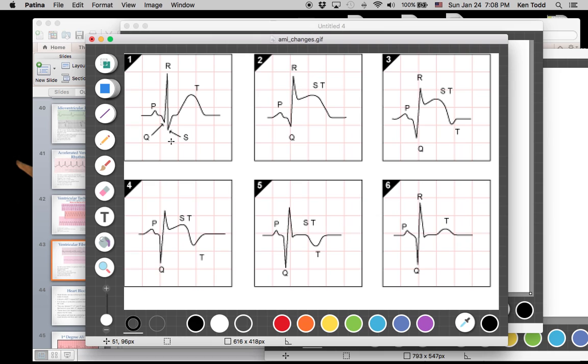not all heart attacks will be what's called a STEMI, which stands for ST elevation MI. But a lot of them will, and it's a hallmark that they used to look for in 12-lead EKGs to determine if someone is having a heart attack. They still follow it up with cardiac enzymes just to make sure, but if you see these, it's pretty indicative. So there's a set group of changes that commonly occur in people when they're having a heart attack.